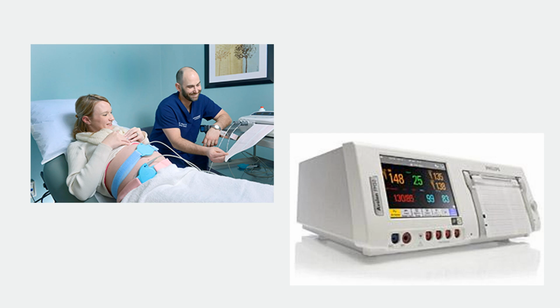That signal and the uterine contractions, they plug into the monitor on the right. Now this gives us a lot of information. So the number on the left there in orange is the fetal heart rate, okay, 148. The green number, the 25, is the contraction monitor. So that number will tend to rise as her belly gets firm, and you'll see that. To the far right, you can see two numbers there. These monitors have the capability of monitoring twins.